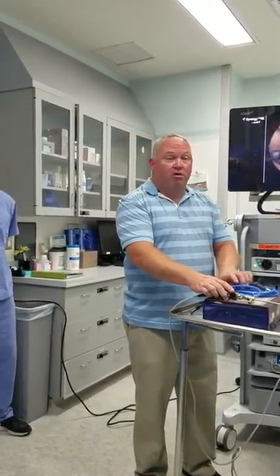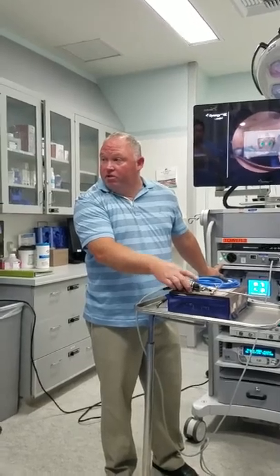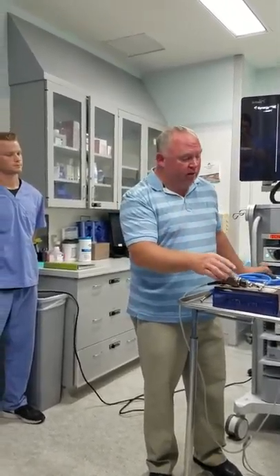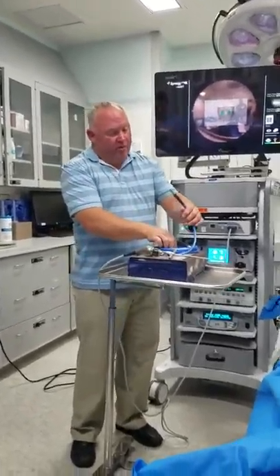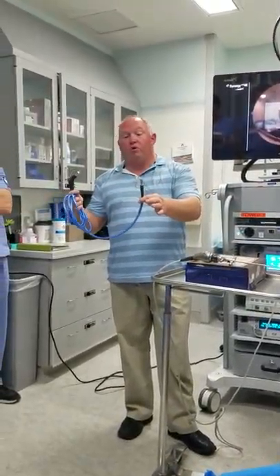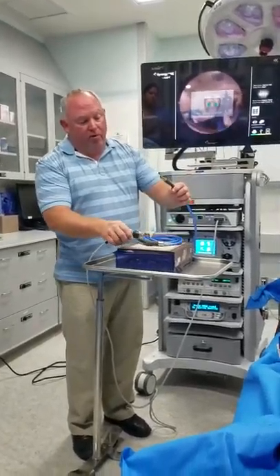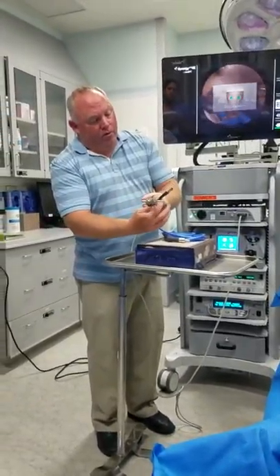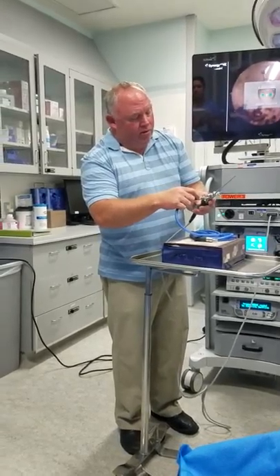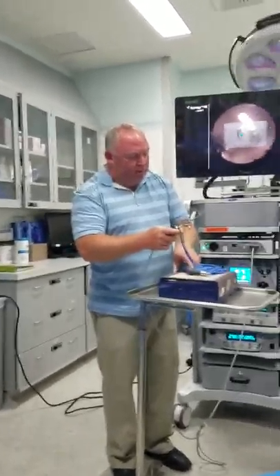If it's going to be on for a long time, let's put the light on standby, please. Just turn the light down, and then turn it back up if we need it. Again, same idea, there's going to be one part that stays with the patient, one part that goes away from the patient towards the machine. So obviously the patient part goes here. That's in.